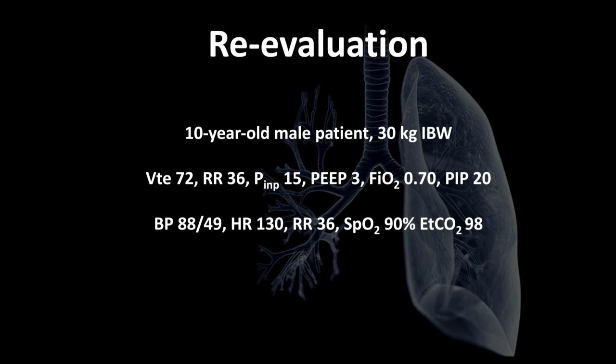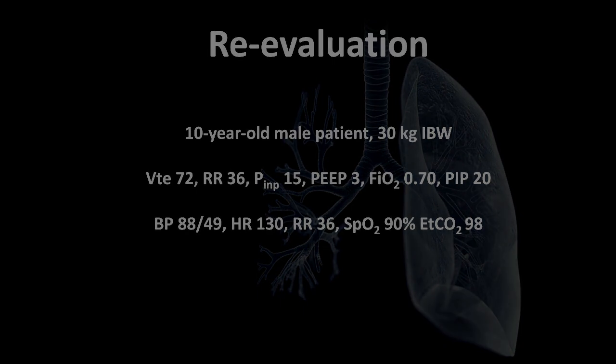Because what they've done is they've now decreased the expiratory phase. So they're not allowing enough time for exhalation. They've never addressed the inspiratory side. They're not generating enough pressure. They don't have enough time to generate a pressure to fill the lungs enough to generate a tidal volume.